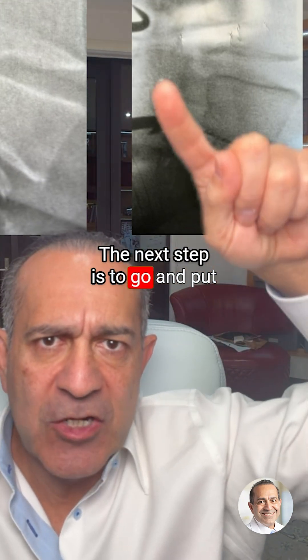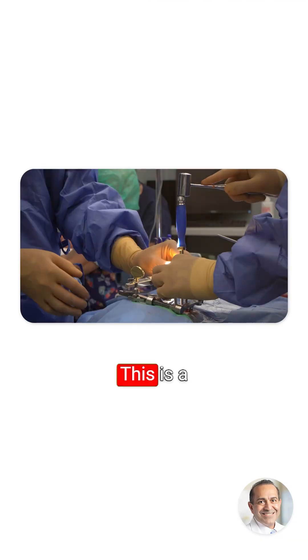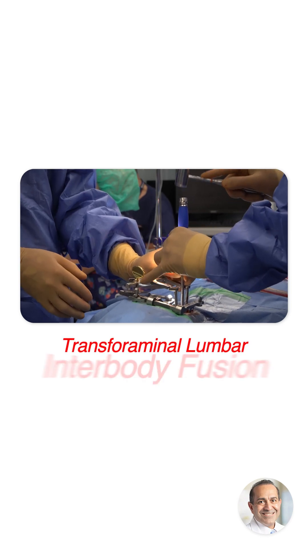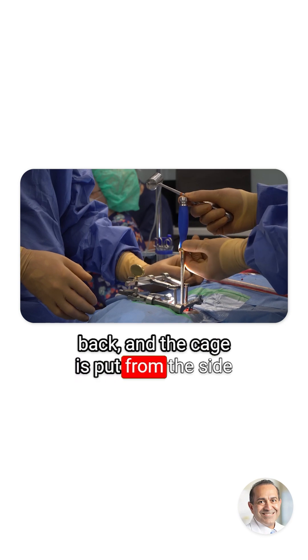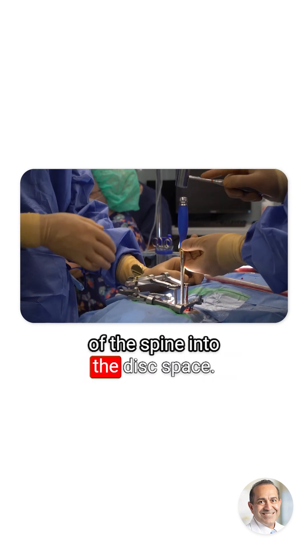The next step is to go and put pedicle screws from the back. This is a transforaminal lumbar interbody fusion with one incision made from the back, and the cage is put from the side of the spine into the disc space.